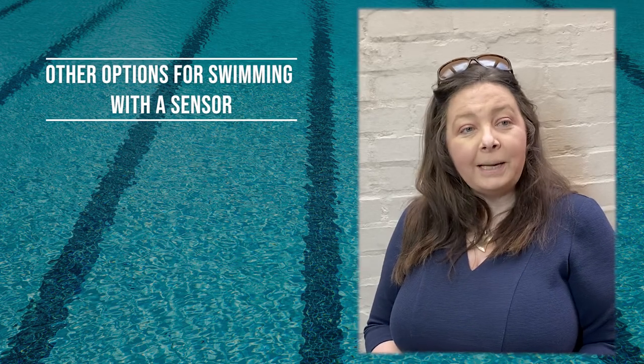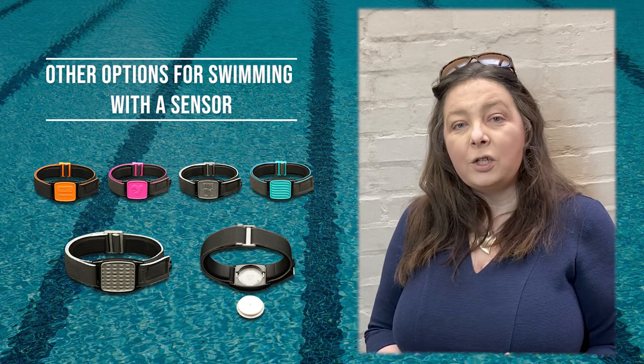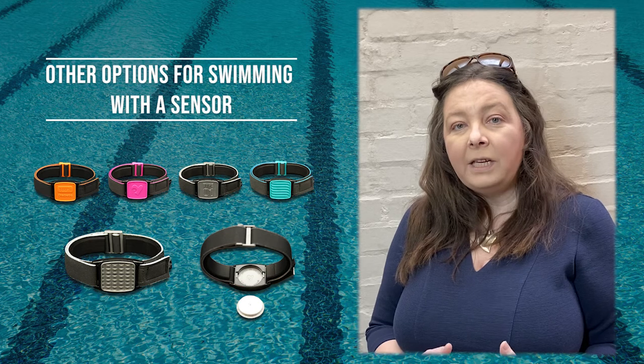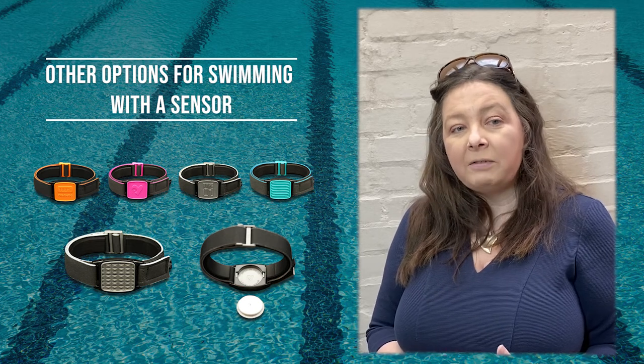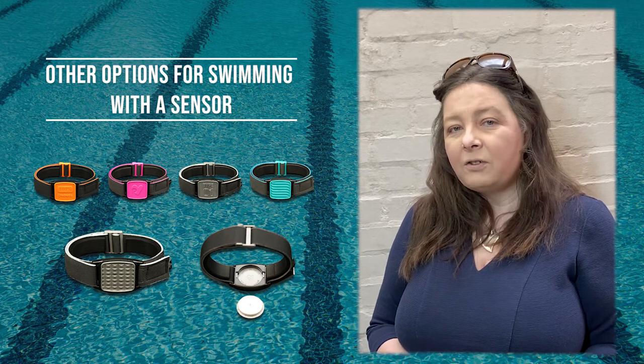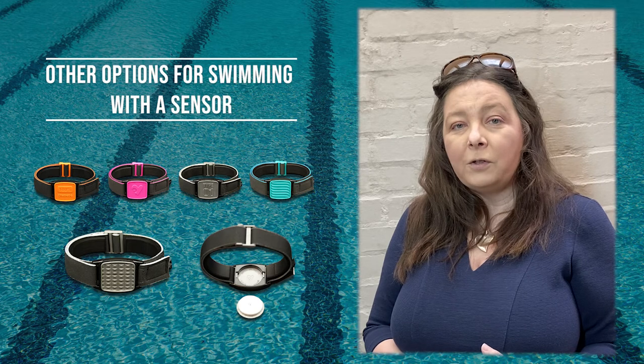Another option is the Libra band. Our Libra bands help to protect sensors from the friction caused by swimming and generally being in water. The cover and neoprene armband are themselves water resistant, although like other options it doesn't make the sensor itself waterproof, but they are durable and easy to remove after your activity.